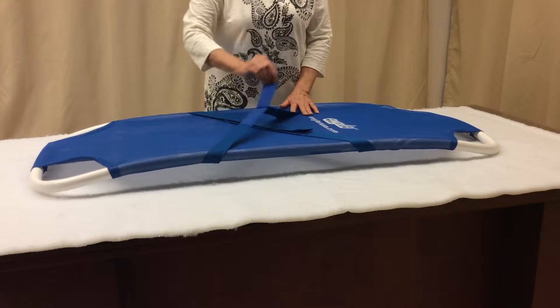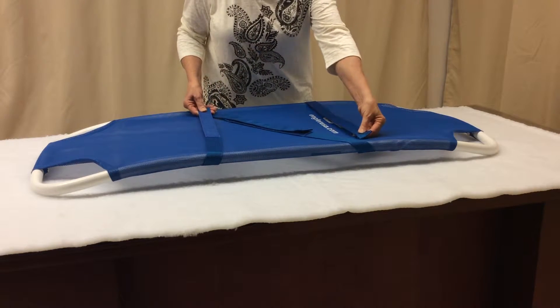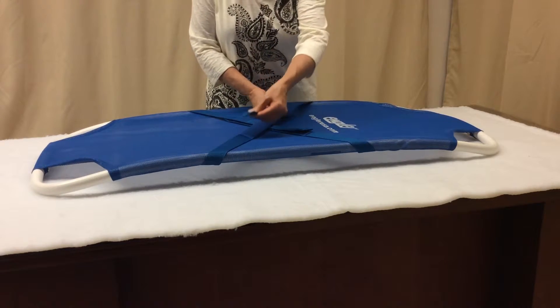The Velcro snaps secure the patient to the stretcher this way or this way.